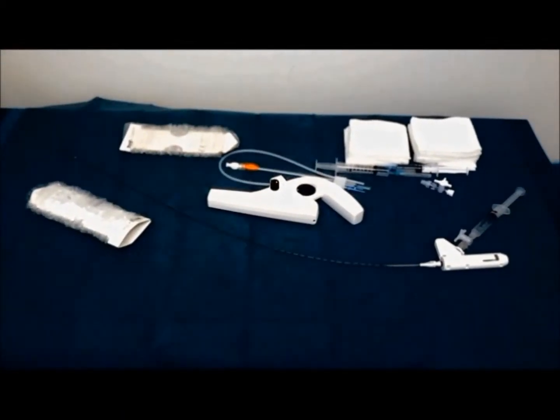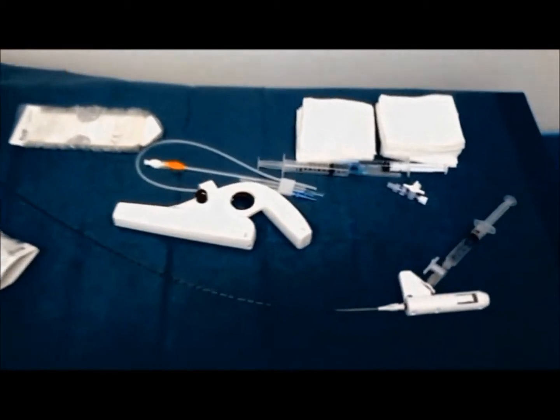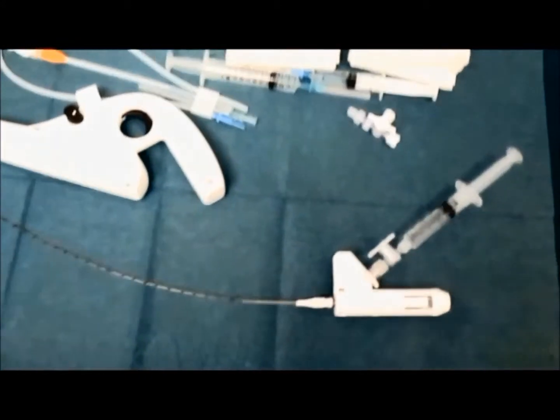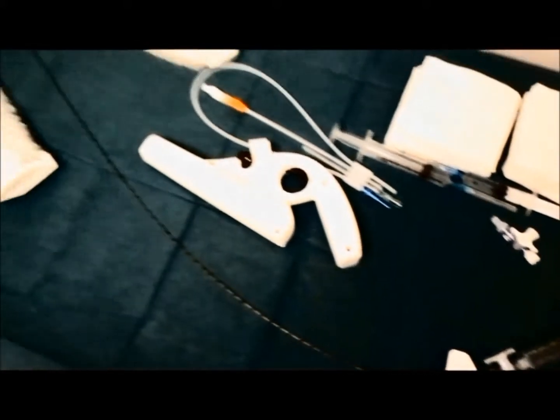The setup for mechanochemical ablation is very simple: a micropuncture set, a catheter with the rotating wire, a motorized handle unit, and a syringe for the infusion of the liquid sclerosant.